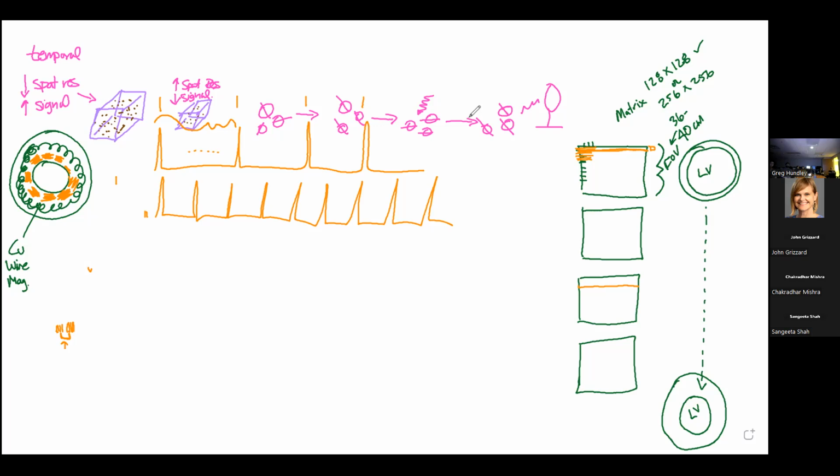This is something that all of the technologists and all of you need to know. What are we going to do to change our strategy with the fast heart rate? Well, in the slow heart rate situation, we had all of this interval of time, right? And we've got this beautiful movie over here with lots of pieces of information acquired, with the first heartbeat, the second heartbeat, etc.